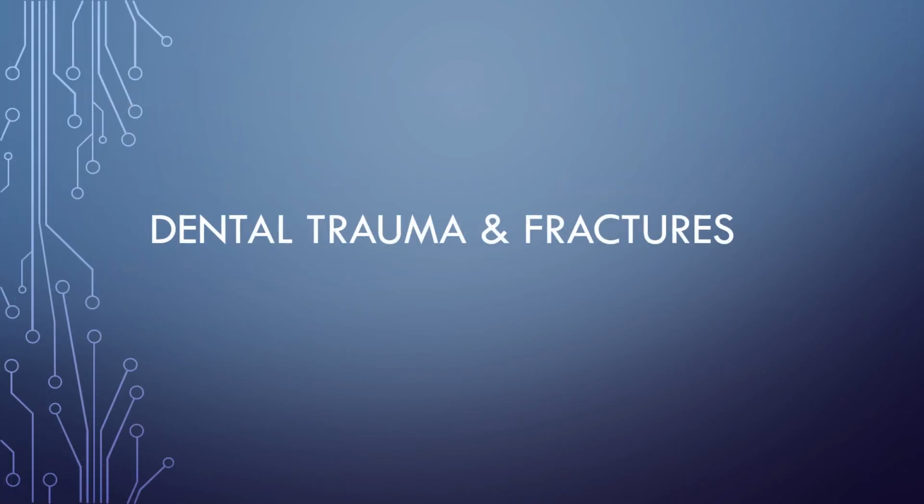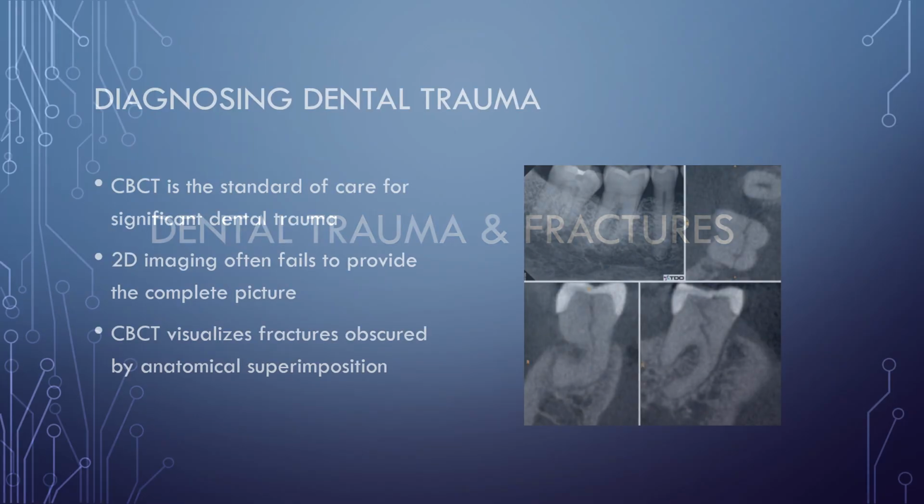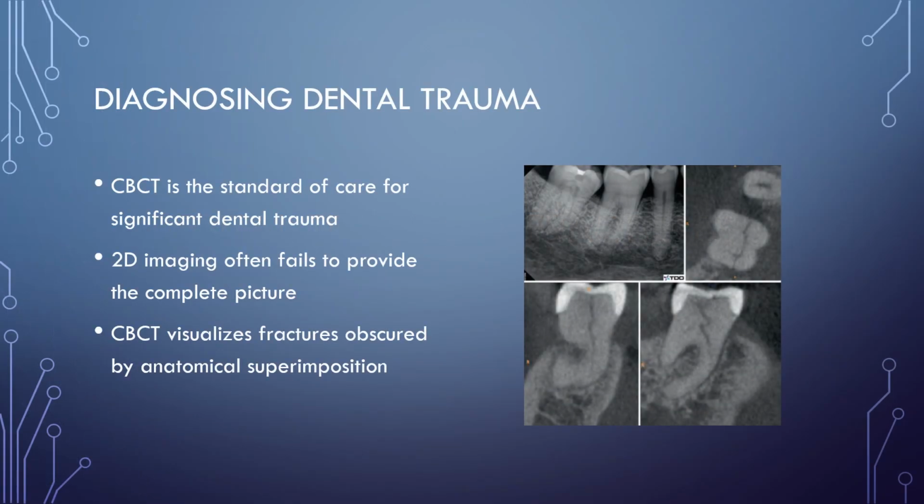Dental trauma and fractures. In the realm of endodontics, diagnosing traumatic dental injuries can be incredibly complex, and traditional 2D imaging often fails to provide the complete picture needed for an accurate diagnosis. For this reason, Cone Beam CT is widely considered the standard of care for evaluating any significant injuries.